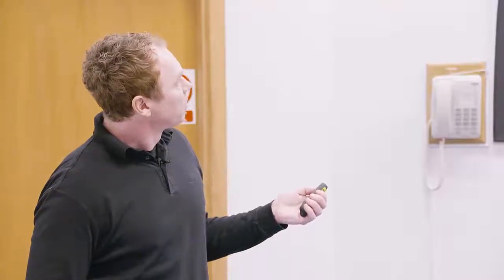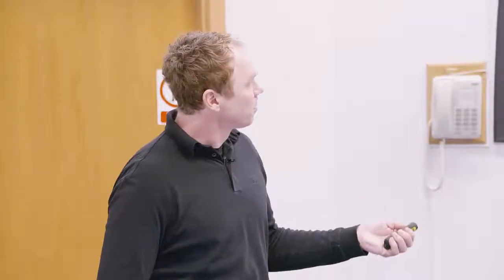First page, usually it's always the same, it shows this picture. Then on the second page you have the explanation about the protocol of the measurement. You have the explanation of all the parameters. Then you saw this already. So you have a comparison between left and right for all muscles and all parameters, and overall symmetry is displayed at the end. Then you have functional symmetry displayed here.